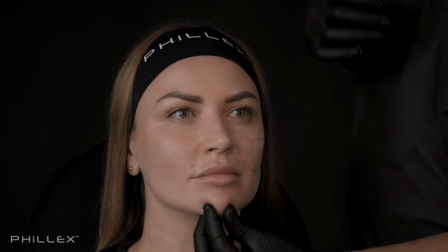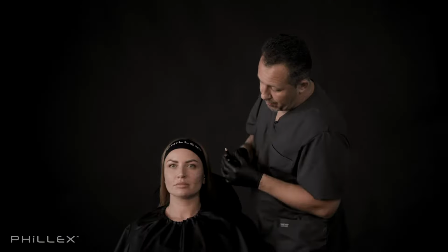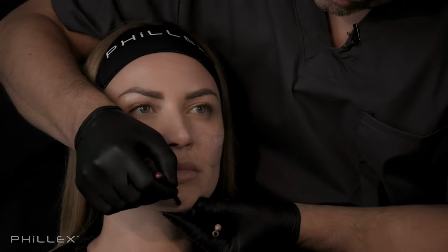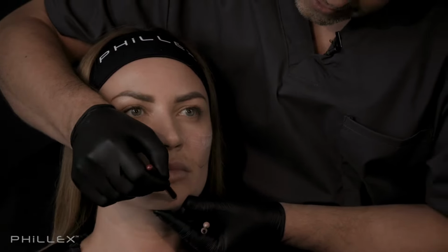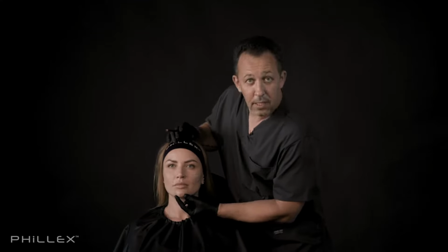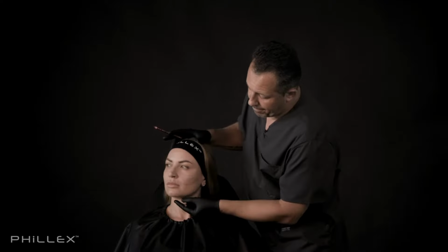One more thing we have to do is to work with her chin. If we put some volume in the lower part of the chin, we will make the face more harmonized, and even more.